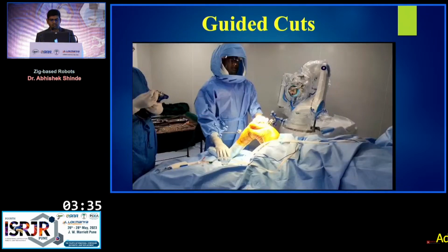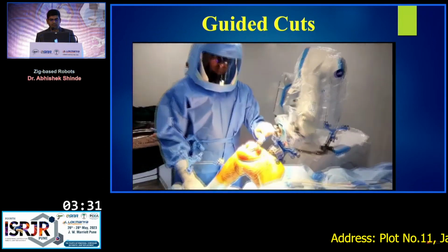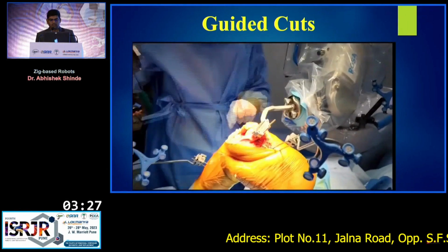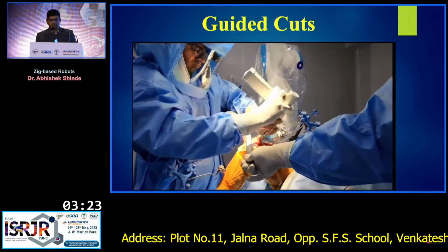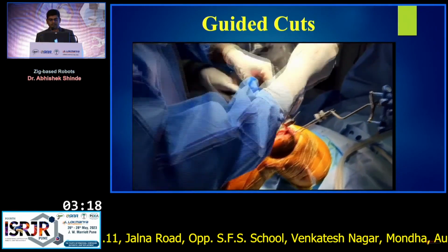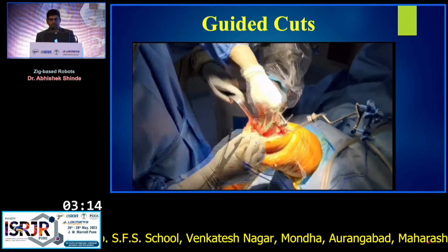So these are the guided cuts. Once the plan verification is done, the jig will automatically come and sit, and then you can recheck the live cut values, and once the cut is taken, you can again check whether the cut was taken properly or not.